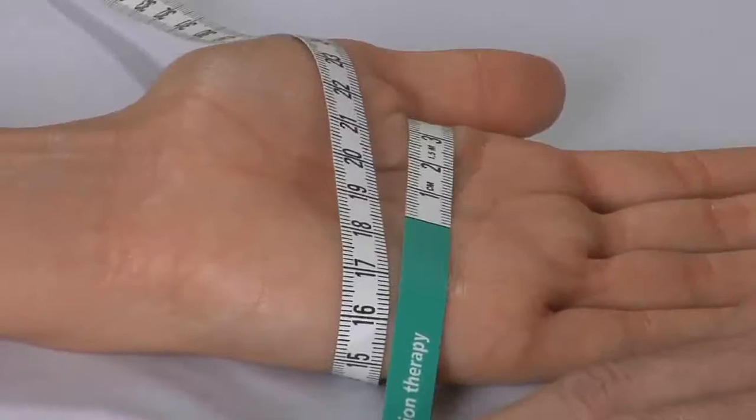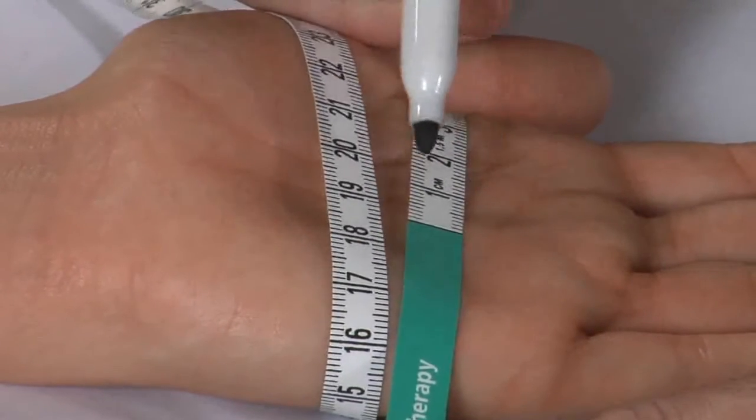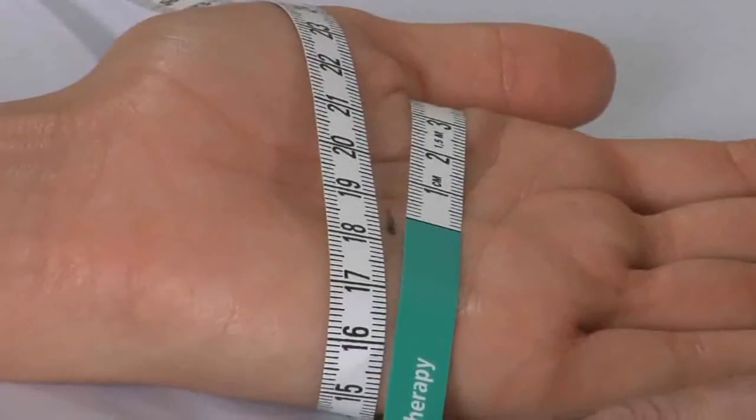Always measure the circumference first. Mark each point with the washable marker. We'll use these points later to measure length. Take these measurements in centimeters, measuring to the nearest millimeter for greater accuracy. The mark should be made on the correct side of the tape. What is the correct side? The side that is located near the point being measured.